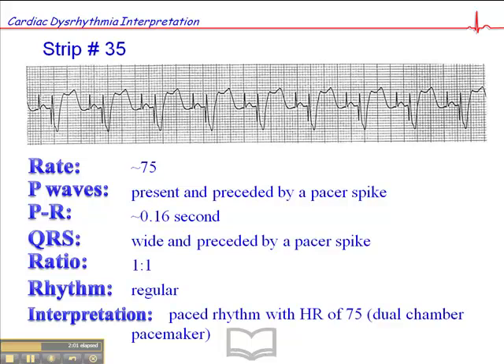What we also often see with paced rhythms is some intrinsic beats as well, so don't be surprised if you see some QRS complexes that came from the patient's heart and then some paced beats — a mix of intrinsic beats and paced beats is quite common. What we're trying to determine with a patient in a paced rhythm is whether the pacemaker is functioning properly, and in the next ECG I'll give you an example of a pacemaker that's not functioning properly.